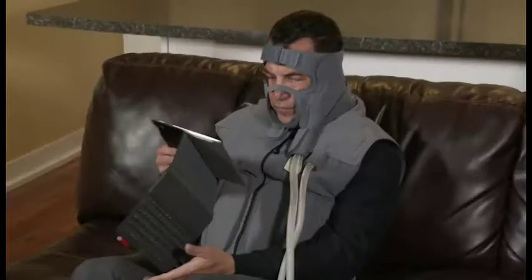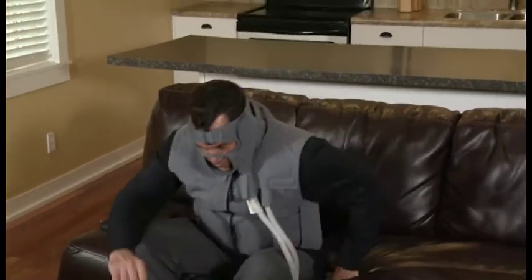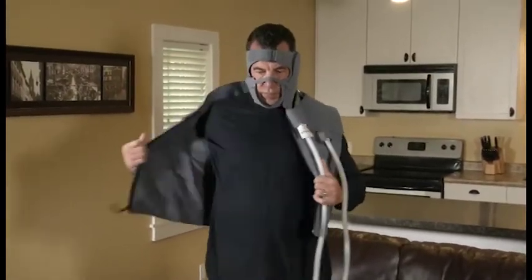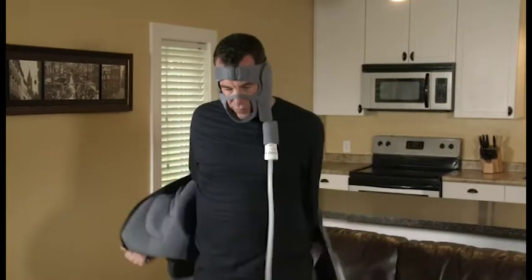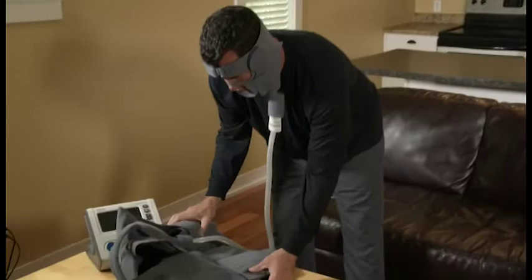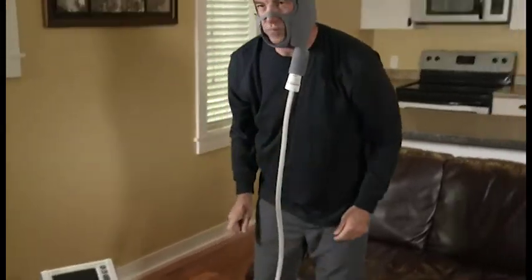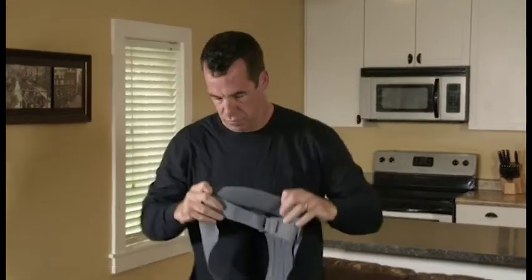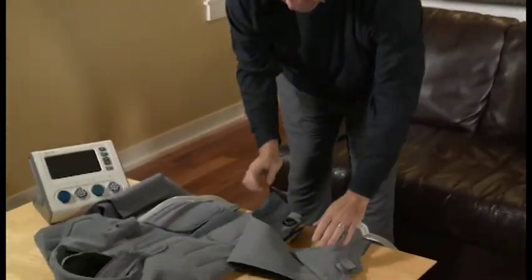To remove your garments at the end of the treatment session, you should remove the vest garment first, followed by the head garment. To remove the vest garment, unzip the vest and slide your arms from the armholes. To remove the head garment, start by unfastening the chin strap and nose piece, attaching the nose piece to the side of the garment so that it does not get lost. Slide the garment off the top of the head, leaving the forehead strap fastened for the next use.